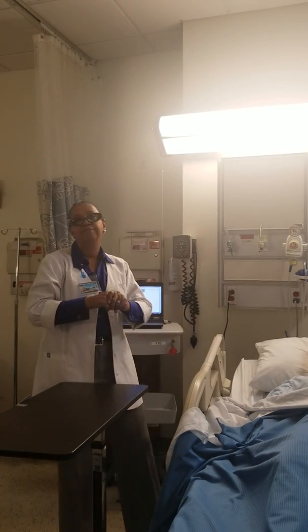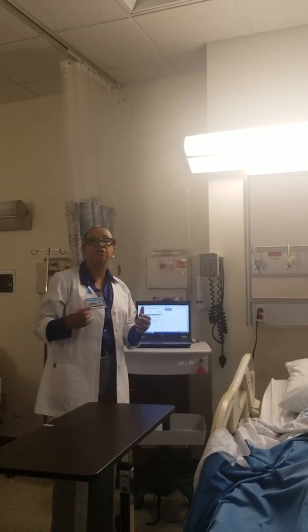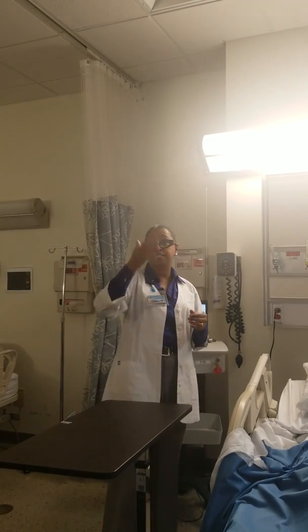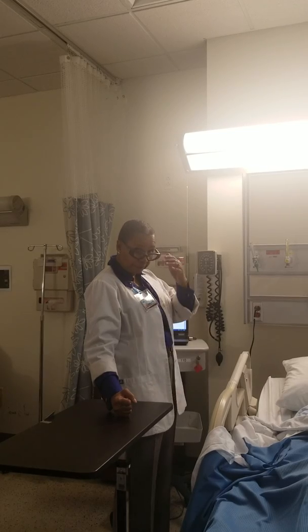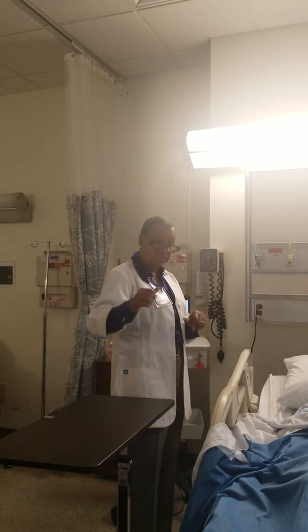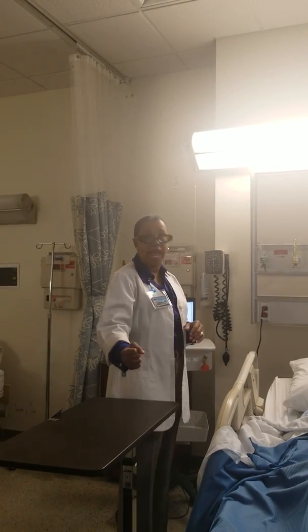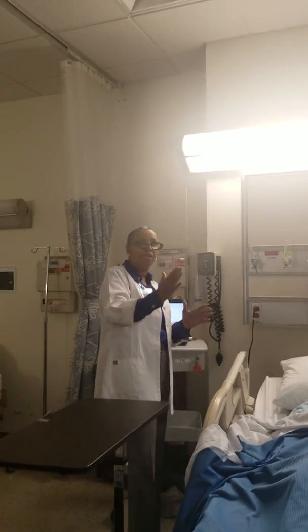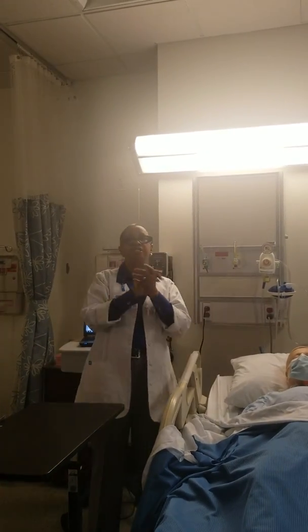Absolutely. They get really excited when they're sinus rhythm, like, yeah, I can do an ultrasound. Sinus rhythm, I know that's a regular rhythm. I'm going to have some consistency. I can lay it on there and just wait to pick up the sinus rhythm. With AFib, it's all over the place. It's irregular. So when I put this, I have no consistency. At that point, that's when I need a still picture and an X-ray to see where it's sitting. Good question.